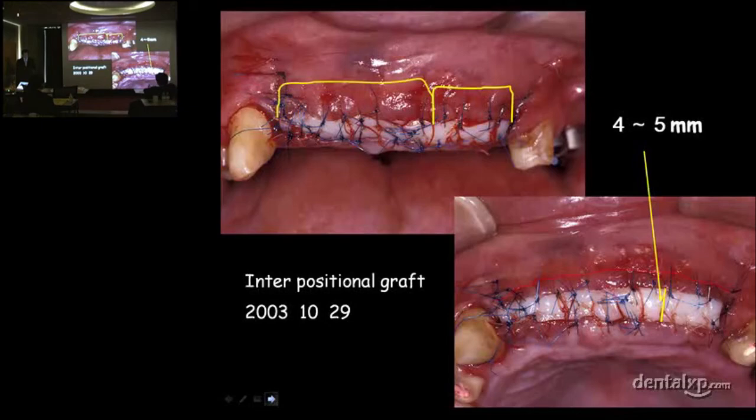After number 9 implant placement, subepithelial connective tissue was stabilized like this. The yellow line shows the shape of the subepithelial connective tissue graft, and the red line shows the apically positioned mucogingival junction. Looking at this photo carefully, you can see that we didn't lose tissue height because the first incision line is well below the highest tissue level.